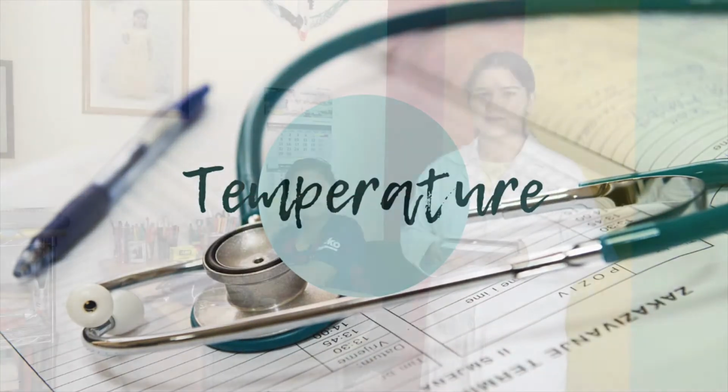Today we're going to take a look at my brother's health. To do this, we're going to run some tests. The first test we're going to run is the temperature.